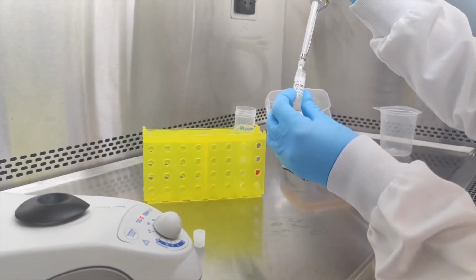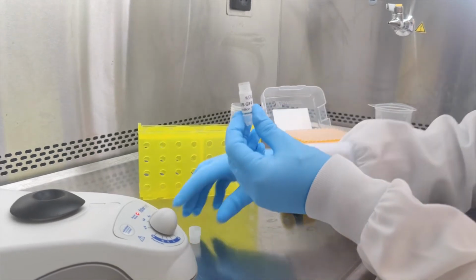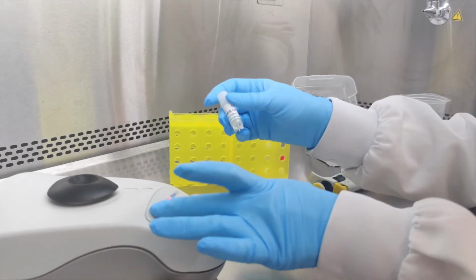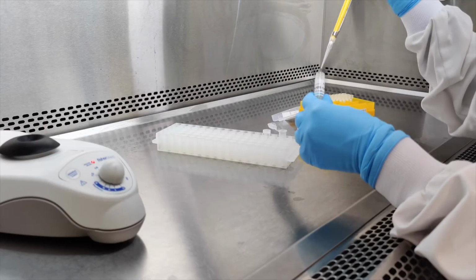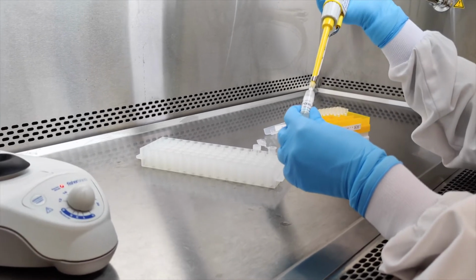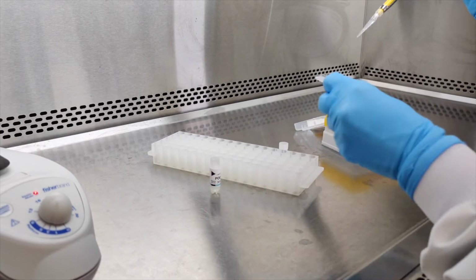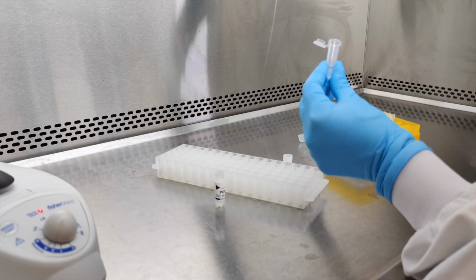Pods are typically reconstituted at 200 million pods per milliliter in PBS and vortex. First, aliquot the desired number of pods for your experiment into a new microcentrifuge tube. Perform any dilutions required in PBS.